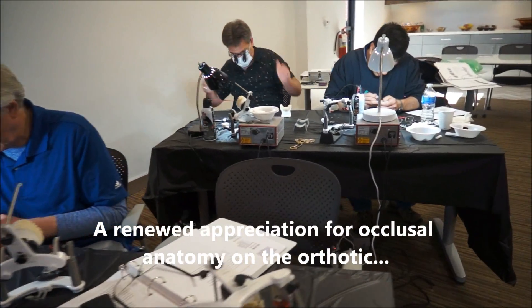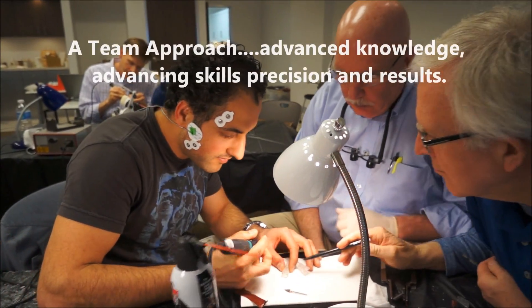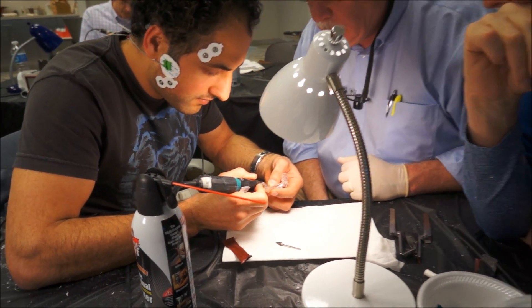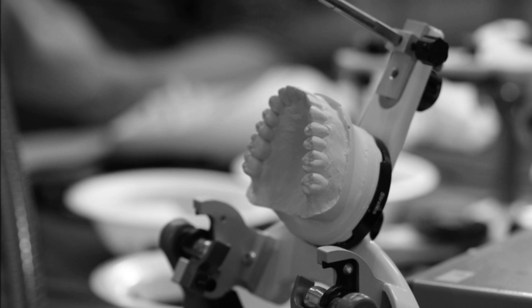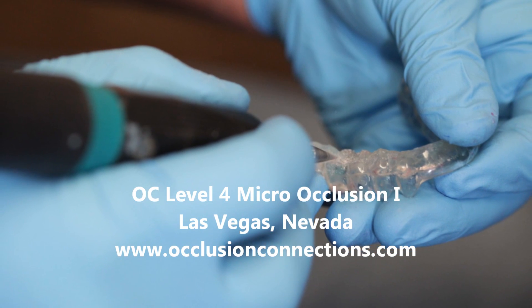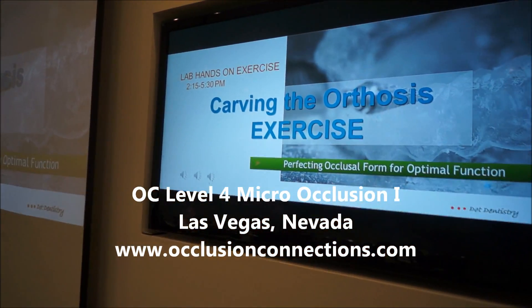Now we're not having to take another couple hours or more. But if you don't even want to go through the pressure point, just have it delivered. These are the masters at work. I'm going to adjust this right here a little bit. This is my understanding — yeah, we've got that.